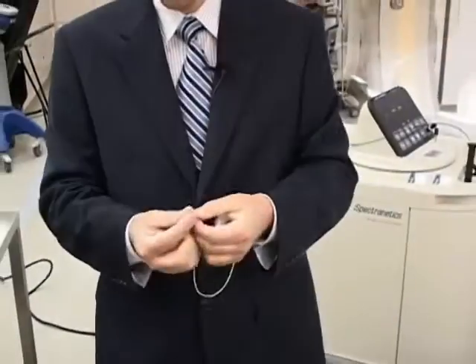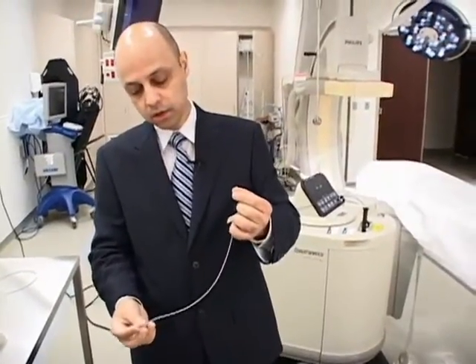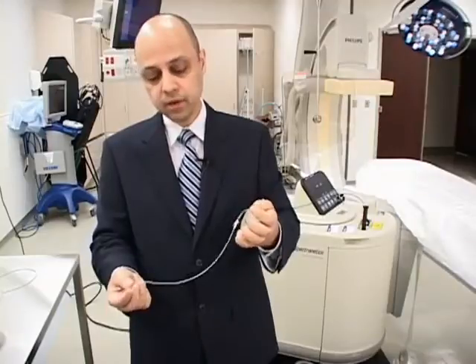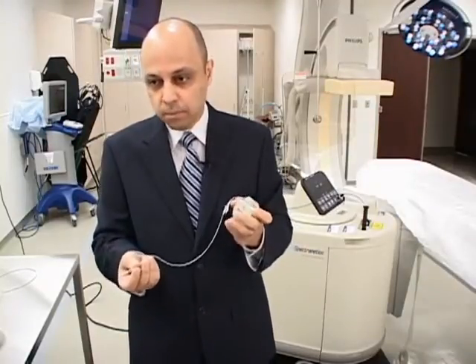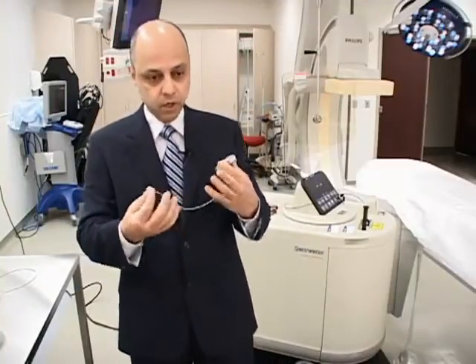the natural healing process of the body starts creating scar tissue — first at the tip of the lead, and then around the lead, creating attachment of this lead to the vein and to the body.